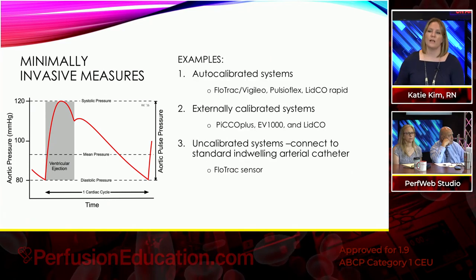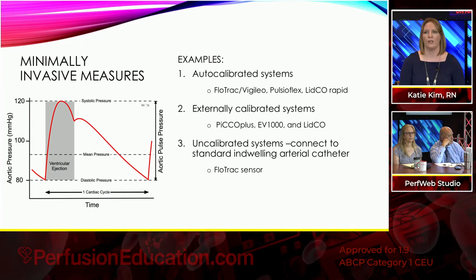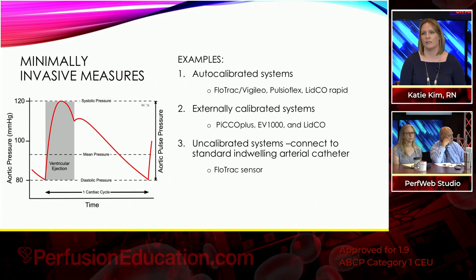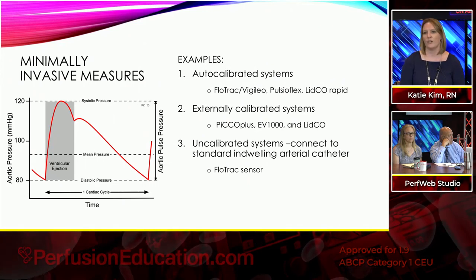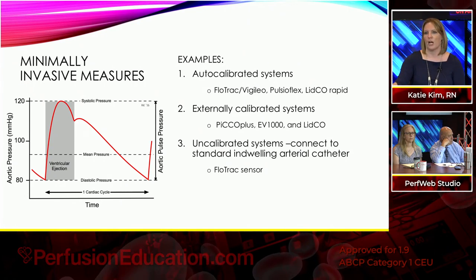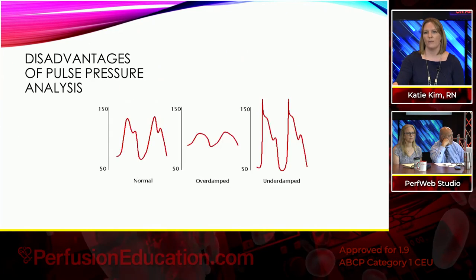Some examples of the minimally invasive measures to measure cardiac output: you have the auto-calibrated systems like FloTrac Vigileo, PulsioFlex, LIDCO, externally calibrated systems, and then systems that are completely uncalibrated, and they're connected to your standard indwelling art line, like your FloTrac sensor. Tammy will go into some of these a little bit more in depth.